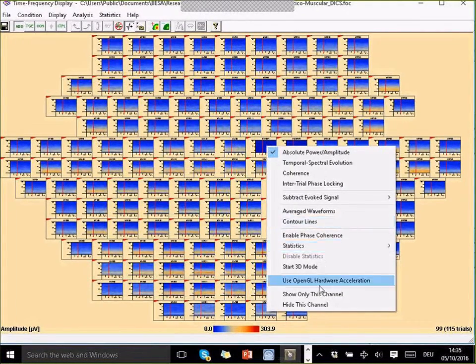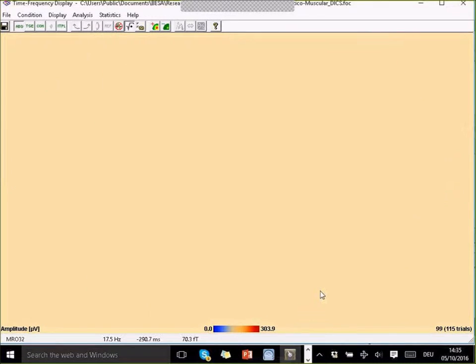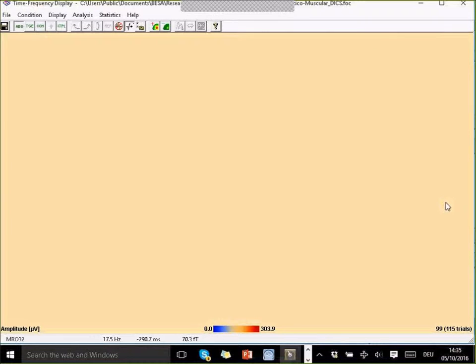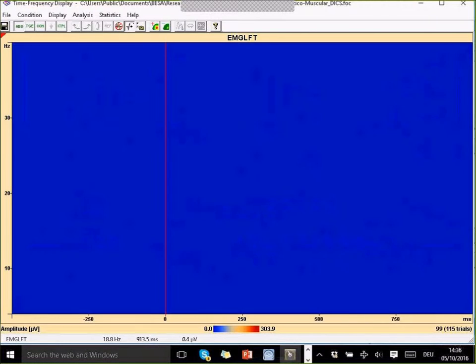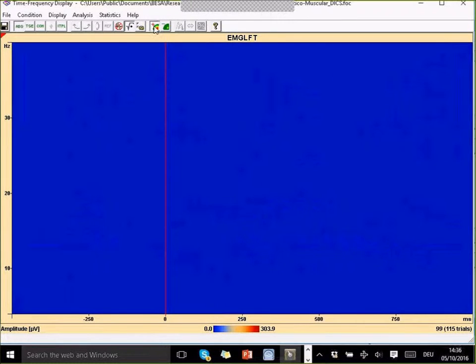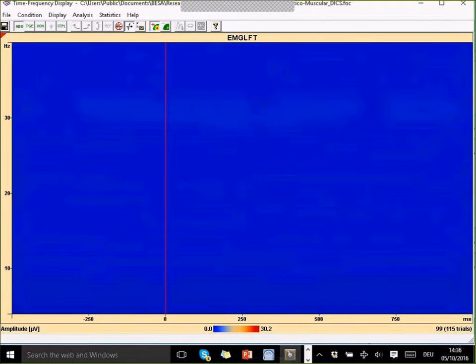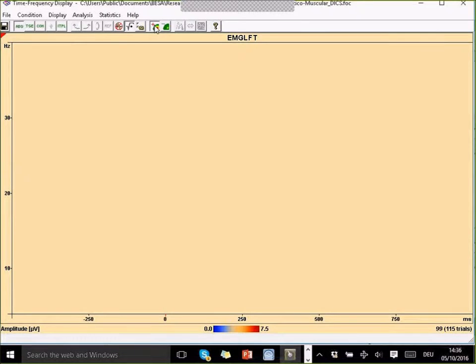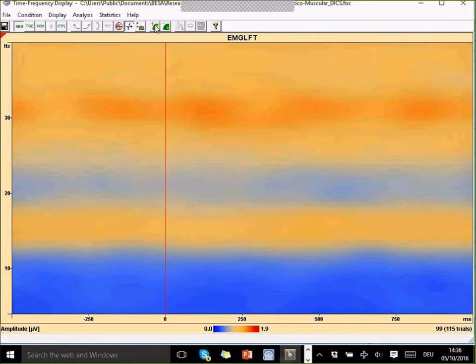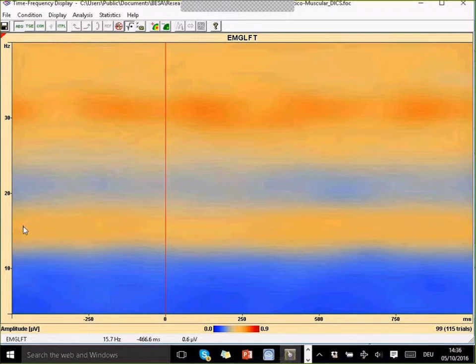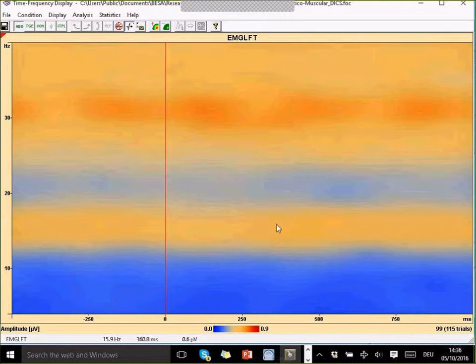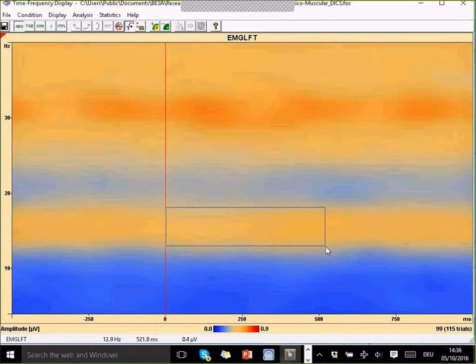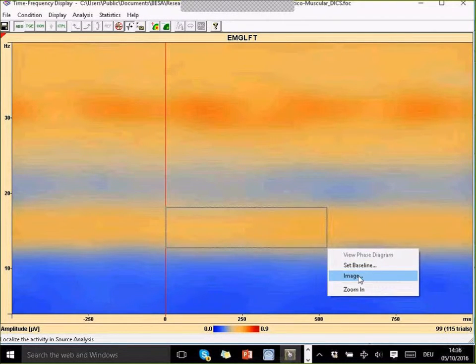This is going to take a little while till all the channels have rearranged themselves, deleted from the display and the new channel is shown. It's going to take another few seconds. Here we go. Now I need to scale this up quite largely until the activity comes up. Now I can see some activation and I can see that at around 15 hertz there is a band of activity that becomes active.